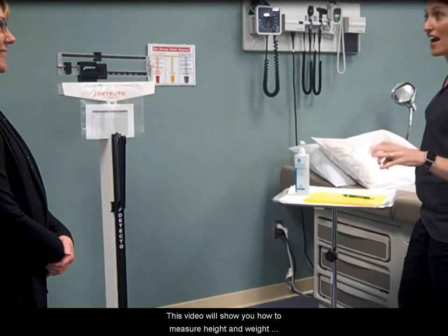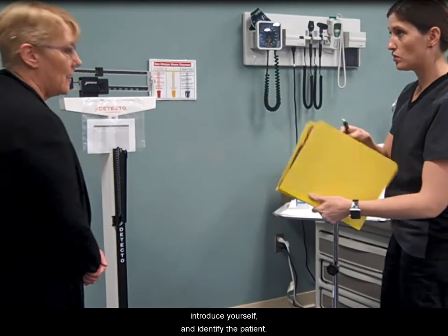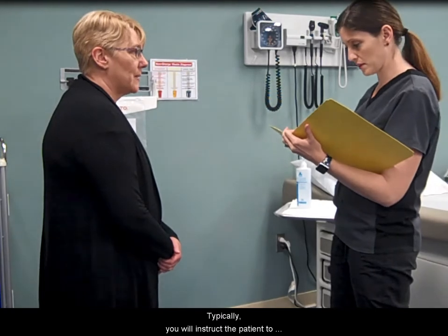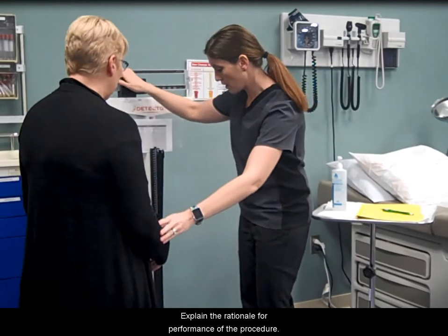This video will show you how to measure height and weight using a balance beam scale. Wash hands, introduce yourself, and identify the patient. Typically, you will instruct the patient to remove shoes and any heavy clothing. Explain the rationale for performance of the procedure.